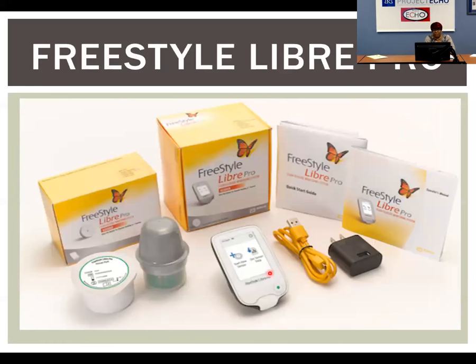And the beautiful thing about this particular device is that it takes about 2 minutes for it to come online and begin to record blood glucose readings. And I have a slide to show the various ones, but the Dexcom takes about 2 hours to begin. It has a 2-hour warm-up period before we'll actually start to record any blood glucose readings for you, whereas this one will start for you in about 2 minutes.